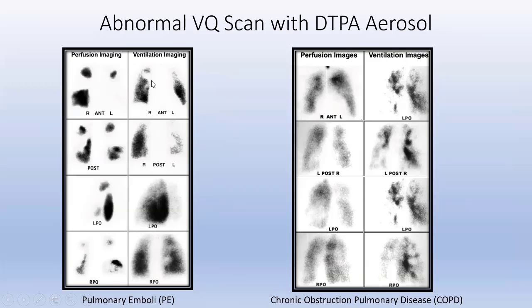On the flip side, if we want to look at pulmonary emboli, again, we have a ventilation lung scan that has got some cold spots in here. So we got some COPD going on, probably a 30-year smoker. And yet here we go, perfusion, we got this huge, big defect here. It fills in. We've got this huge defect here. It fills in. Again, mismatch, perfusion defect, pulmonary emboli.